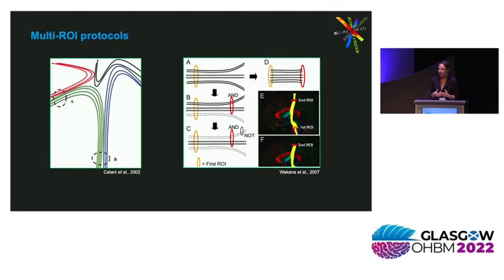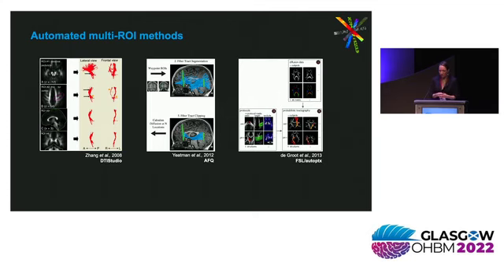And so this set off an effort to come up with standardized protocols for doing this manual editing. These were called multi-ROI protocols because they define each major white matter pathway on the basis of 2 to 3 ROIs that the pathway goes through and maybe a couple of ROIs that it doesn't go through. And these multi-ROI protocols are still the basis for the majority of automated methods for reconstructing tracts of interest today. The automated flavor of the multi-ROI approach simply takes the ROIs from an atlas and maps them to the individual instead of having to draw them manually in the individual.